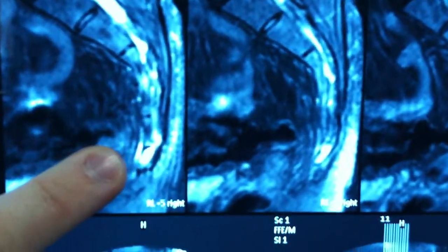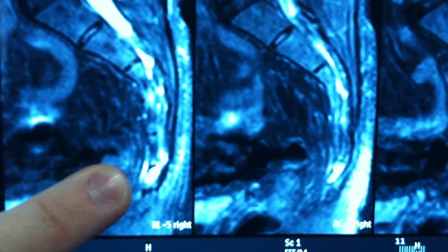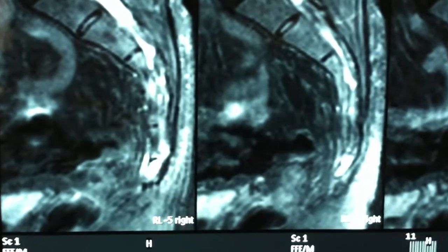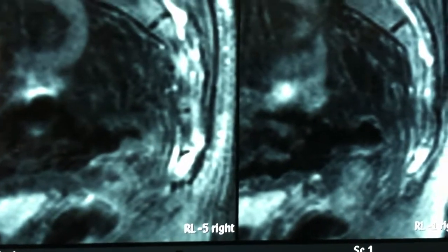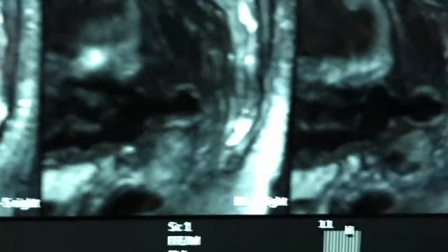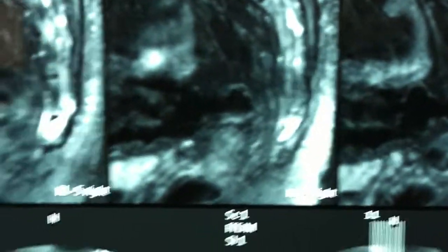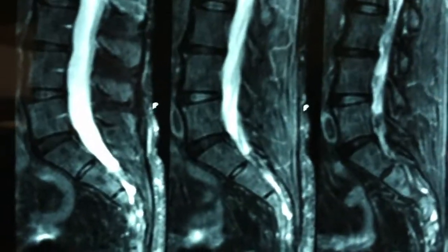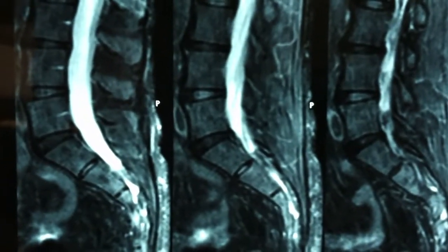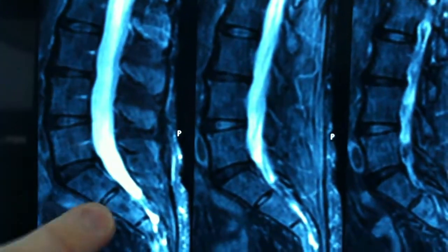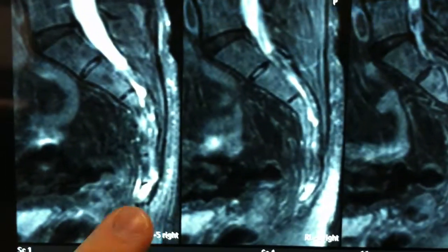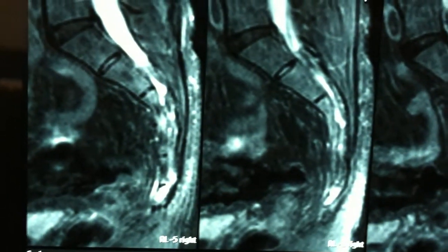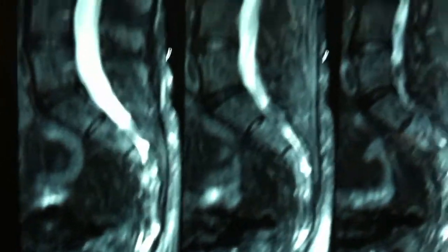You can see that bright signal where the coccyx is lit up, where there's that coccygeal fracture. That's the upper bone of the coccyx. You can see that on a couple of these images. These happen to be what are called T2 images, and fluid shows up bright within T2 images. So certainly that fracture is bright on these images, which is consistent with this being a recent fracture.